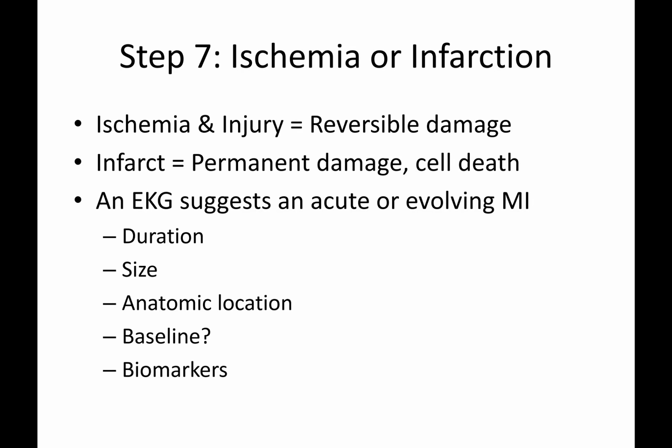Right, welcome to step number 7, the big one we've all been waiting for in our 12 lead EKG interpretation. So this is a big section. Actually, probably the bulk of this lecture has been leading up towards it.